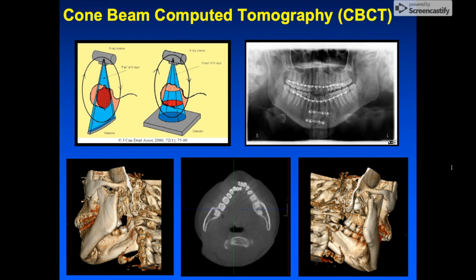The cone beam CT shows both mandibular condyles were fractured here and there. It shows that both mandibular condyles were fractured and displaced medially. There is a fracture through the anterior mandible, here, with the right side displaced lingual to the left. The three-dimensional reconstructed images add clinical value to the report.